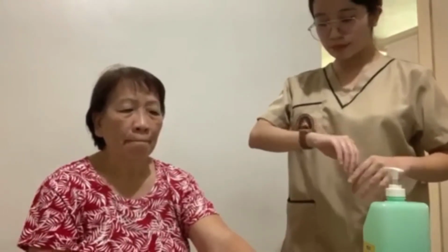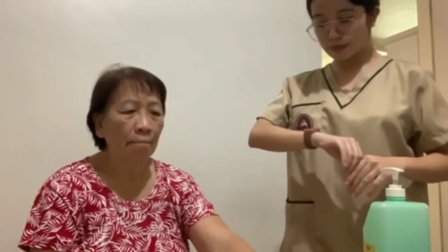And then we set and turn on the alarm when using continuous monitoring. We check the preset alarm limits for high and low oxygen saturation and high and low pulse rates. Change these alarm limits according to the agency policy. And ensure that the audio and visual alarms are on before you leave the client.